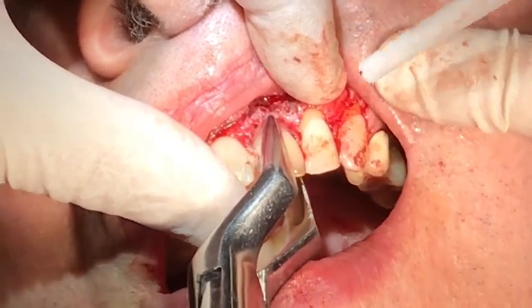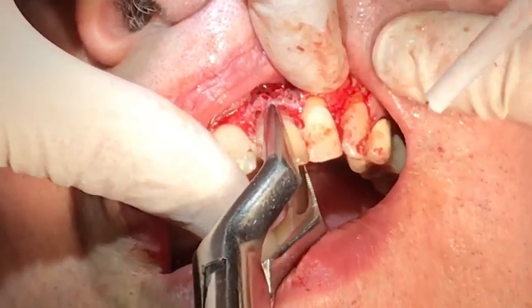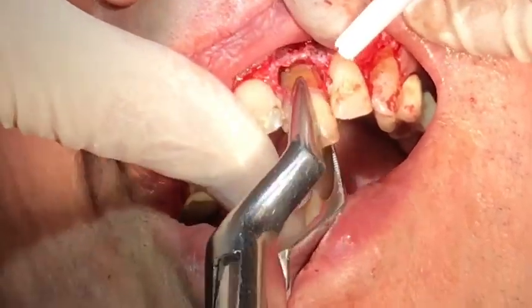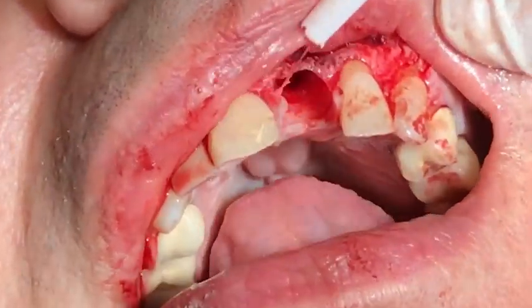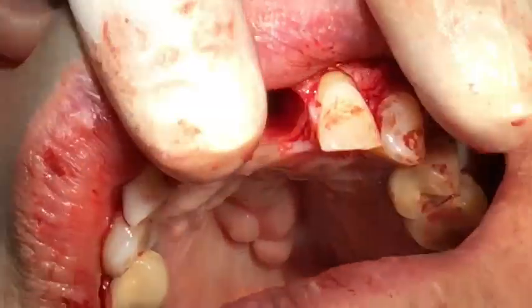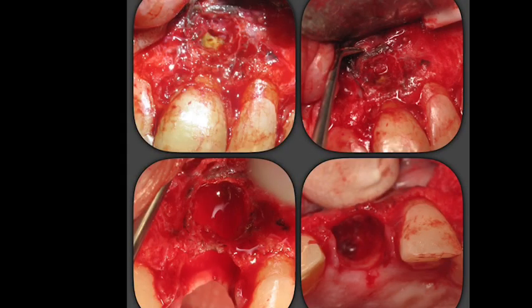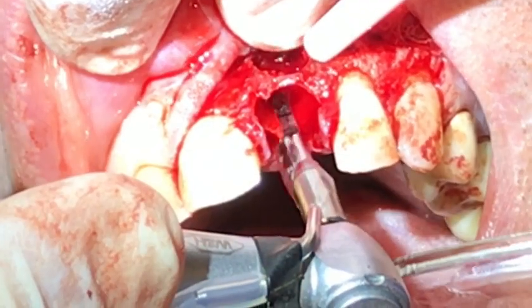A 65 maxillary forceps was used and the tooth was successfully removed. Upon examining the extraction site, a large degree of apical pathology was present and there was significant bone loss on the labial. In fact, there was just a small isthmus of bone going from number eight to number nine.